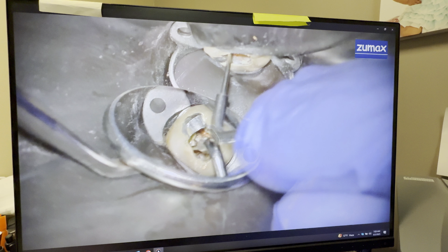So if it binds to the canal, it can crack, it can break. All right, so let's go ahead and make our own custom gutta percha master cones. Here I'm using a 25 4%, and I'm putting it to where it wants to go until it binds. It doesn't want to go anywhere. I measure it to my reference point where I got my working lengths from, and then if it's longer, I cut it. And that's how I make my own master gutta percha cones.